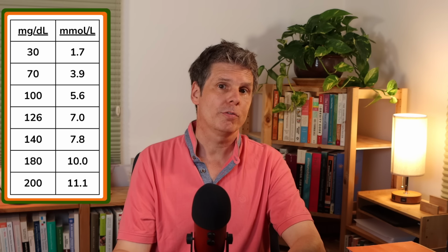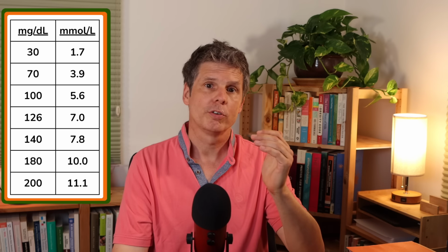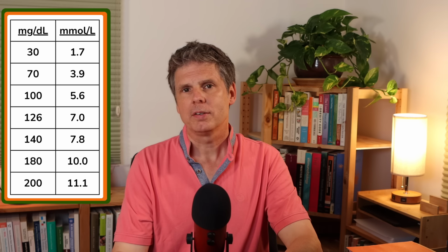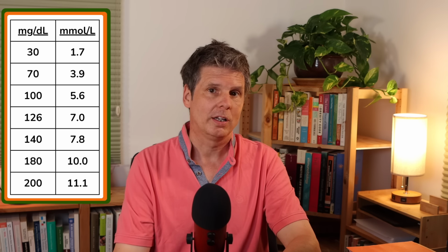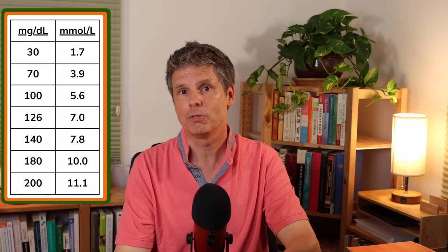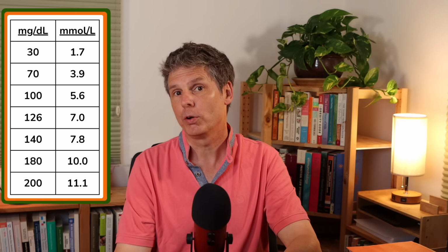Okay, so we have discussed how we can use our fasting glucose levels and the glucose levels 2 hours after we started eating a meal to get a sense of whether we are glucose tolerant or intolerant. What about that time between the fasting state and the time point 2 hours after a meal though? That's actually the most interesting time because that's when the blood sugar level rises to some peak and then falls back, ideally to baseline. Is there anything that could happen during these 2 hours immediately following a meal that could alert us that maybe our blood sugar regulation is not perfect?